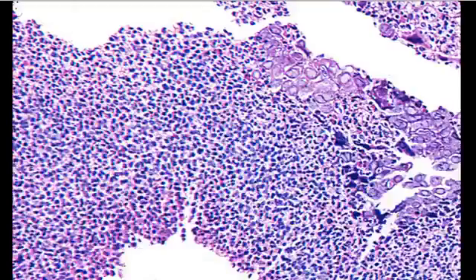This was a case I had as a fellow here that spurred my interest in herpes. And it wasn't so much the infected epithelium in the upper right-hand corner, but this diffuse field of these big convoluted-looking lymphoid cells that we were a little bit worried could be a large cell lymphoma.